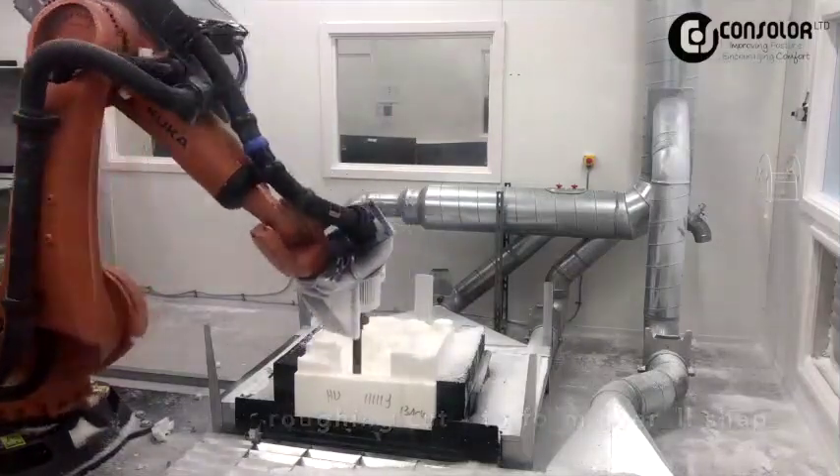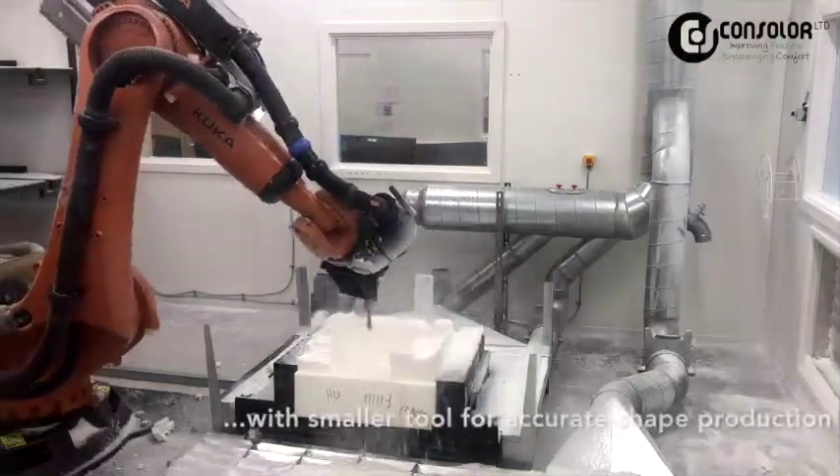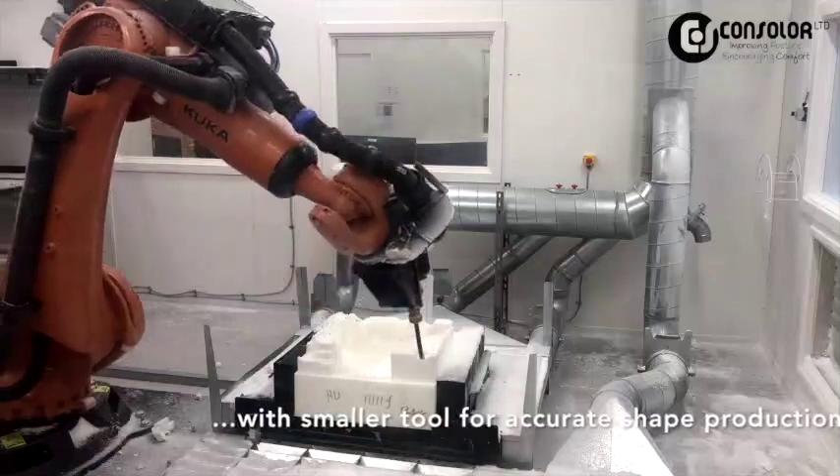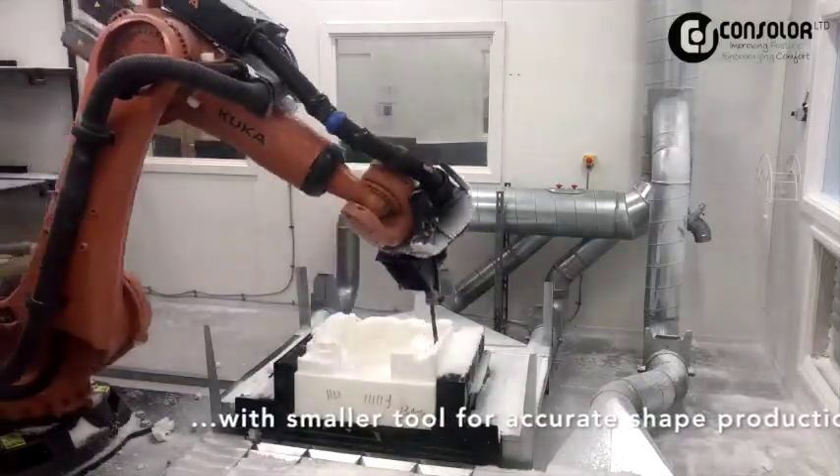At Consola, we've created the seat design process in-house, so we have a unique and bespoke programming and workflow system that suits the products that we are manufacturing. No compromises.